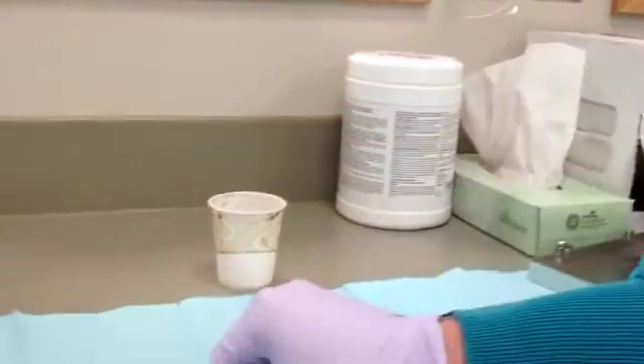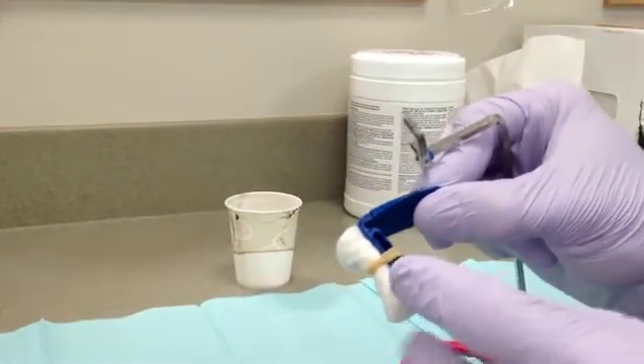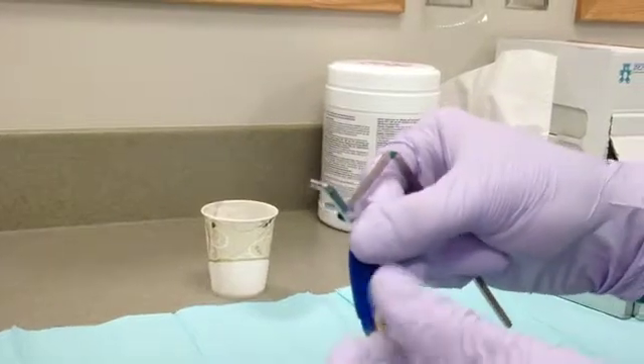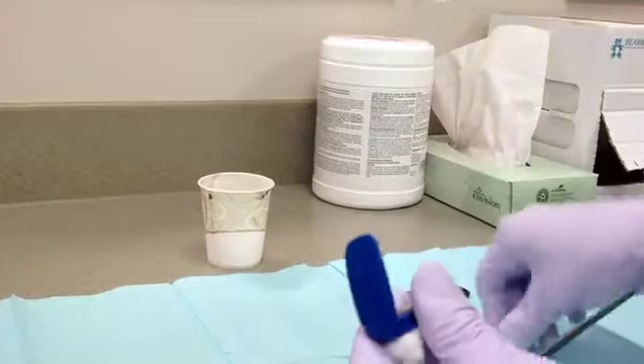Before attaching the bite block, a cotton roll should be secured with a rubber band to the bottom. This will make it easier for the patient when biting down. When attaching the ring, make sure that the bite block is centered.